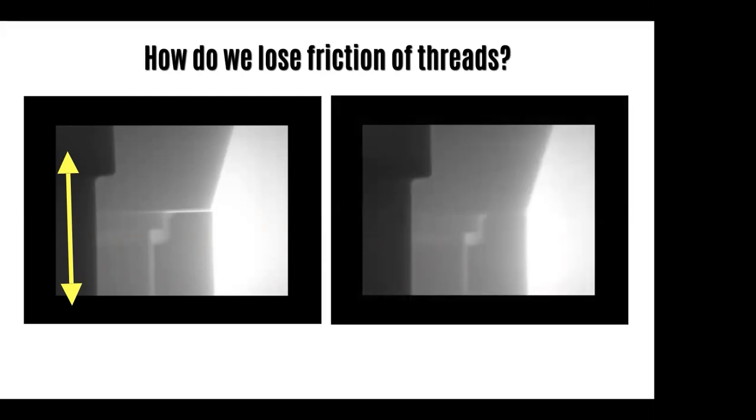But what about when the gap closes? What happens to the screw then? It gets shortened, doesn't it? The screw gets shortened and it loses its preload at this time. What about friction? It'll decrease also. So this is pretty much when the screw rotates counterclockwise by losing its friction.